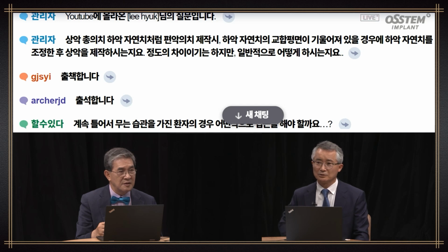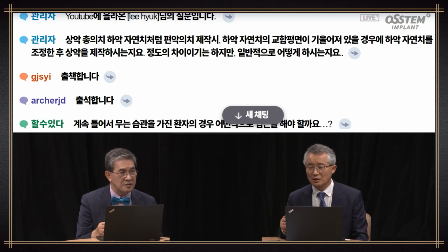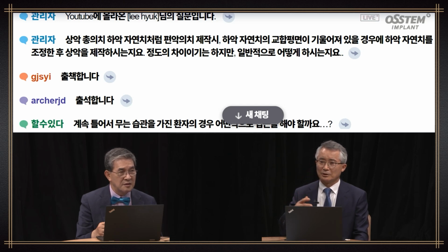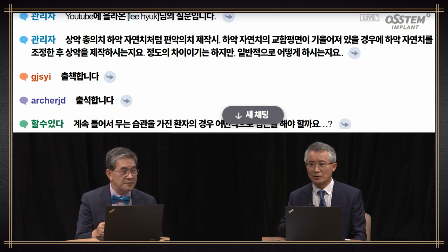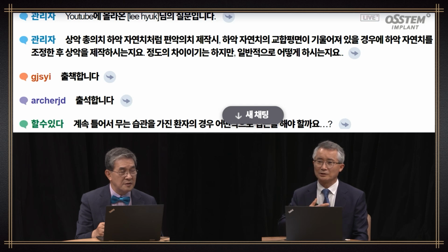If there is a difference in occlusal plane, such as due to over-eruption, then I suggest providing a crown prosthesis. In the past, I didn't do it, but then I ended up with some problems. If possible, we need to provide optimum results. There can be differences between patients, so we need to look at the occlusal plane and make a decision. If possible, I do make adjustments.